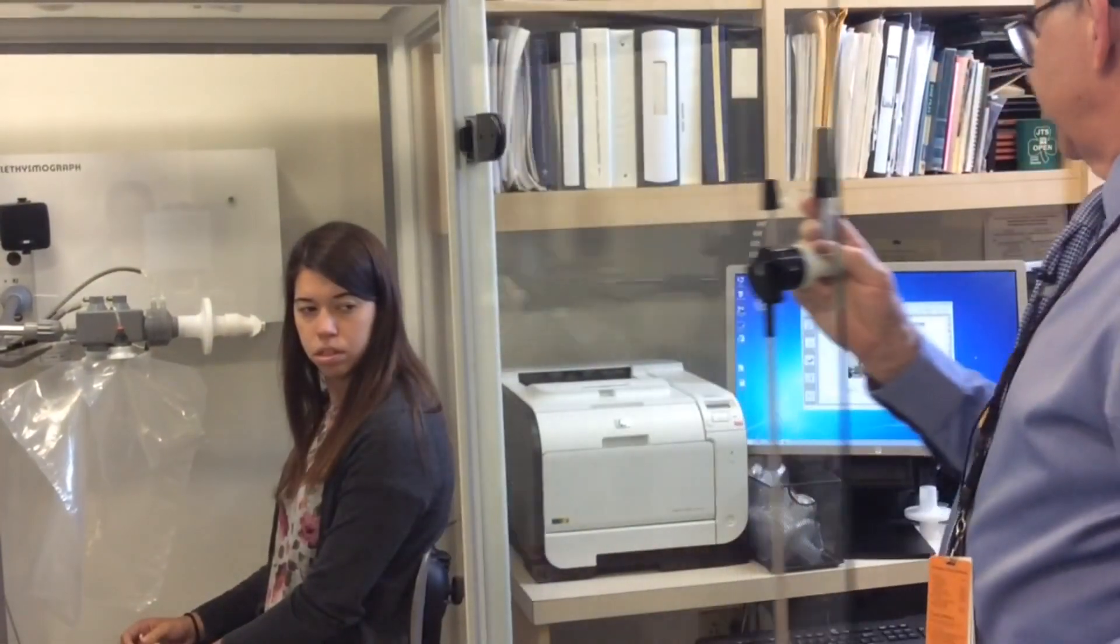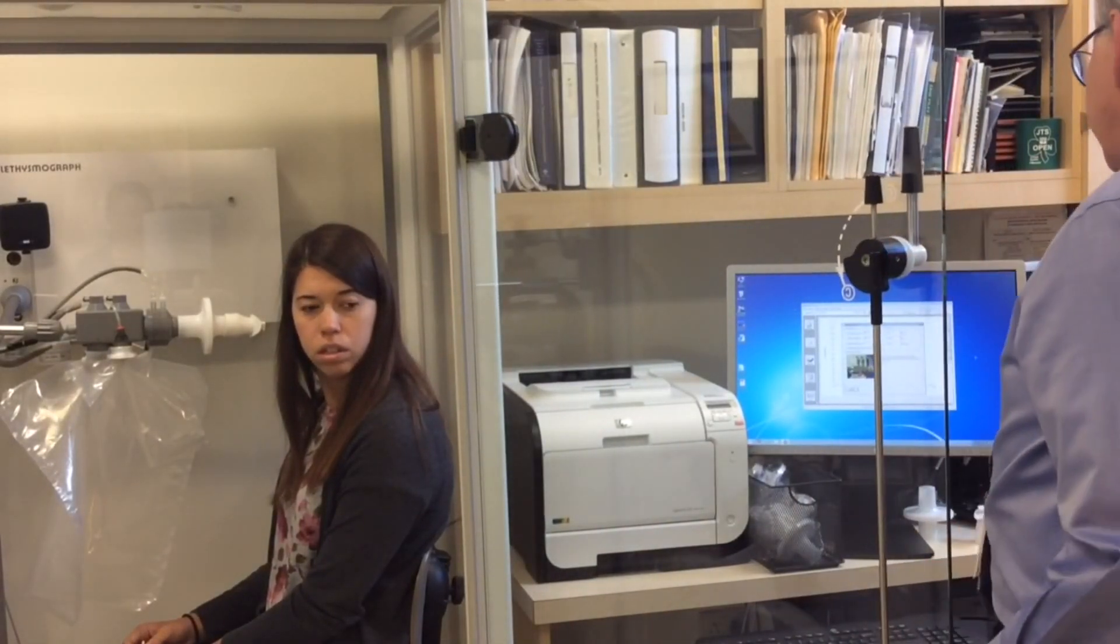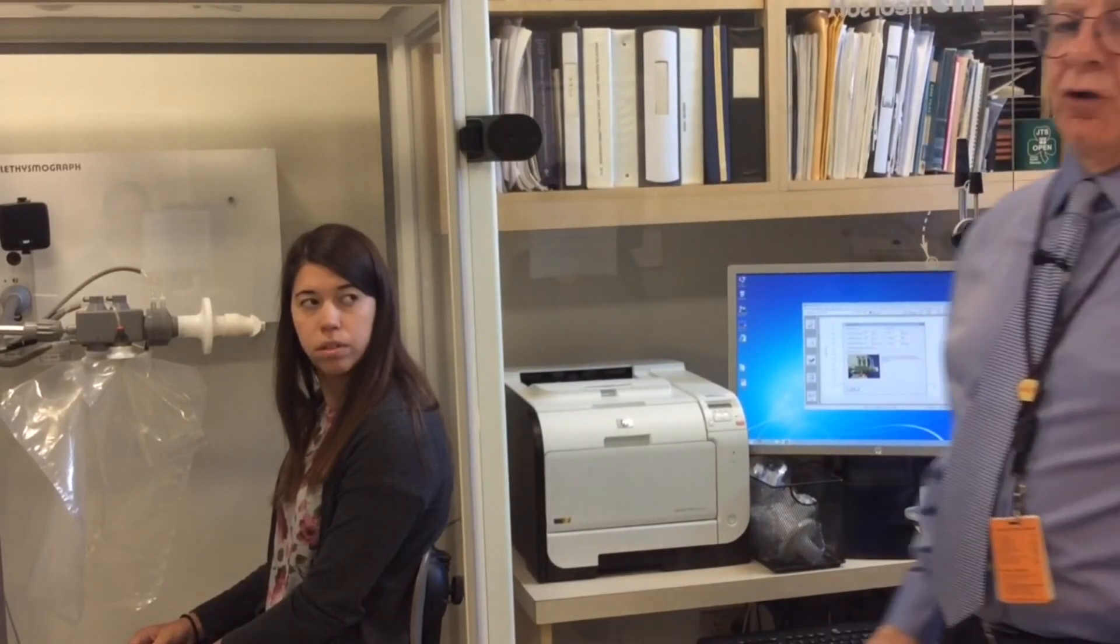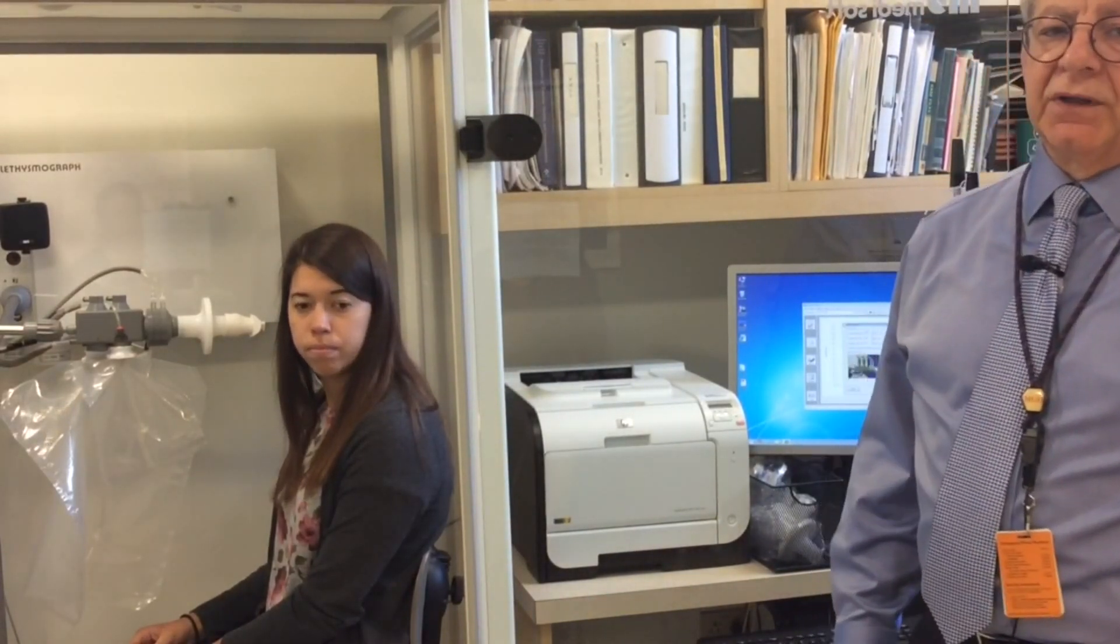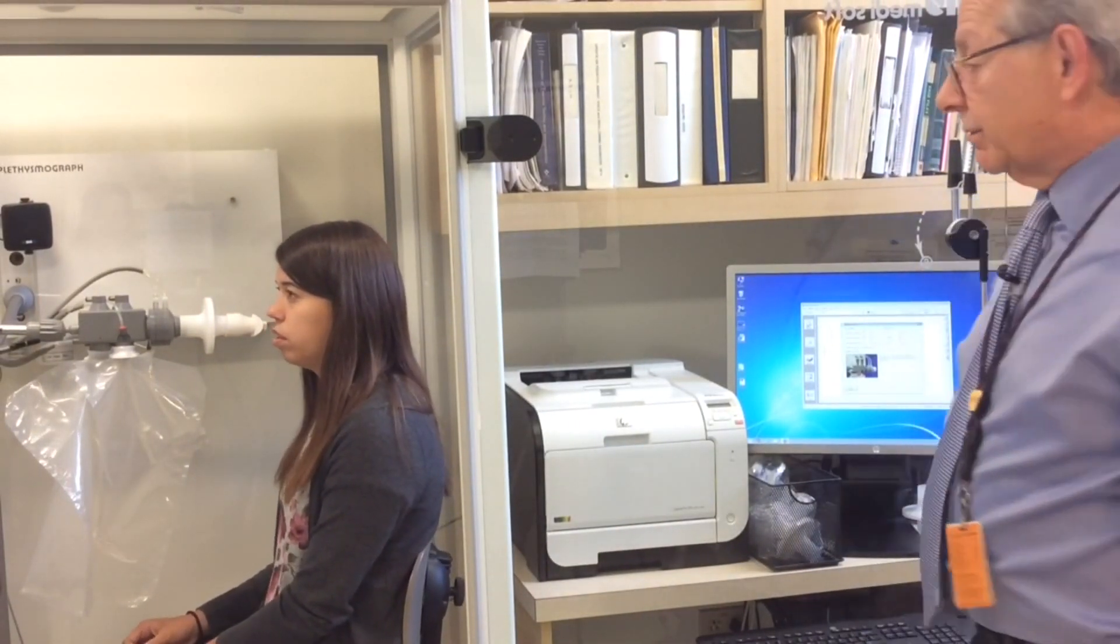So we can leave the door open for this test. And we can also usually plug in a patient's hemoglobin. If it's available to us, we'll plug that into the equation. It just makes it more accurate. So actually carrying capacity is determined by your hemoglobin.